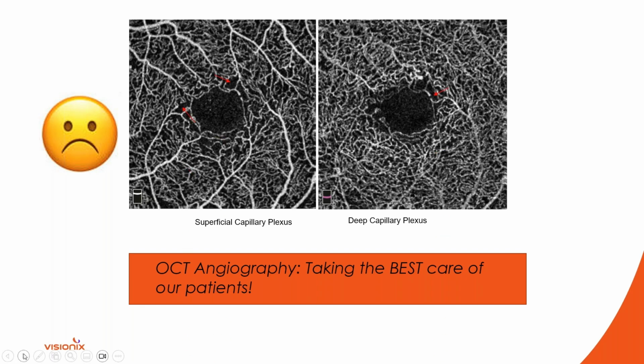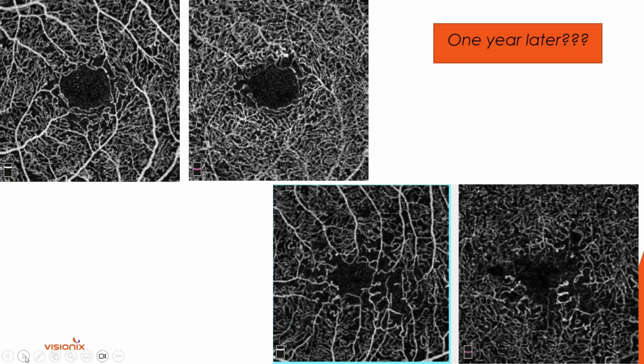And this is what you don't want to happen. Hold on, I don't know why I'm not advancing here. Oh, sorry, they're on my arrows.